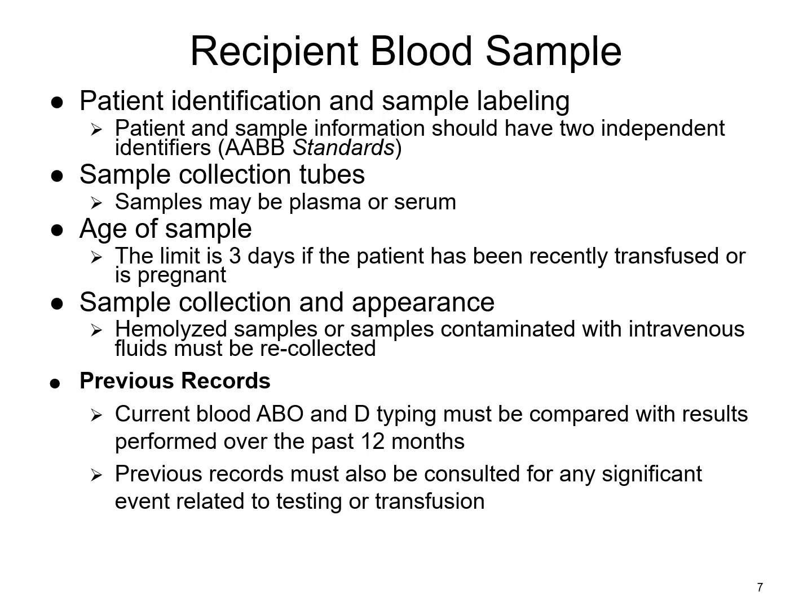Once you put those samples in the refrigerator and use them after they're a week or two old, then you can start seeing that fibrin form in that sample, and you can see that when you're doing your testing as well. So make sure that when you're at your sites and you're going through clinical and things like that, you are asking them what some of these things are. Ask them what fibrin looks like in your testing when you're doing testing in tube, just so you're aware of what fibrin actually looks like, because it can make you think that there's an actual clump or agglutination that's taking place.